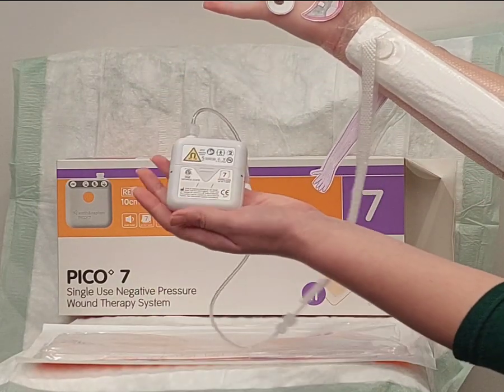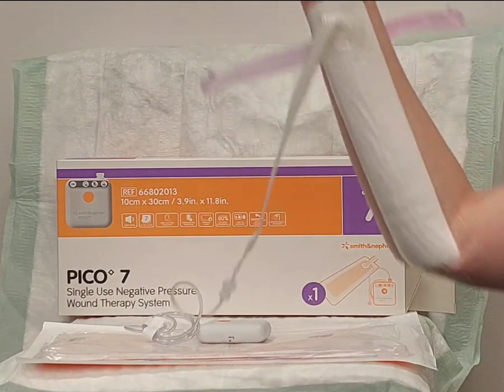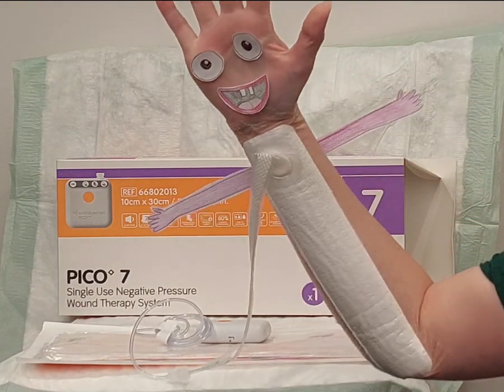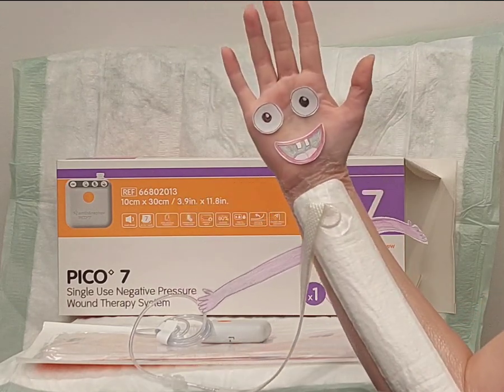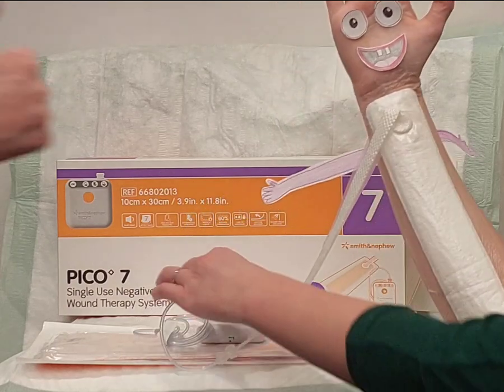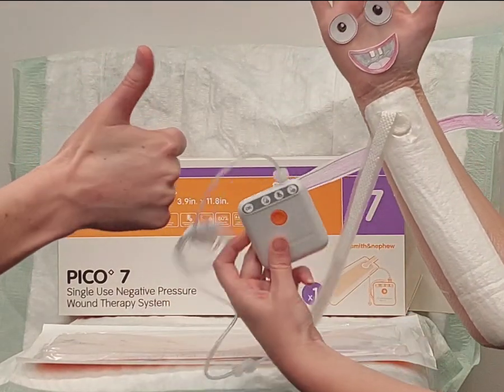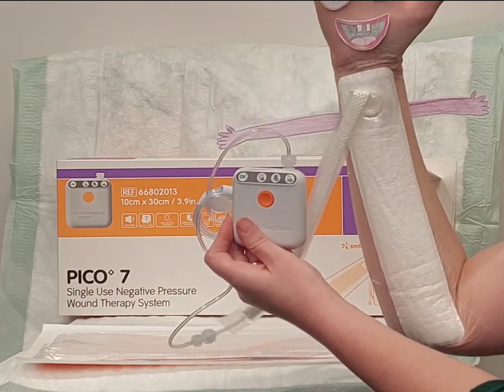So to recap, the key points: Pico is a single-use negative pressure wound therapy. The pump contains a magnet and must be kept away from other implanted medical devices and MRI. If a green light is flashing, you're all good. If an orange light is flashing, you need to check the seal or change the dressing.